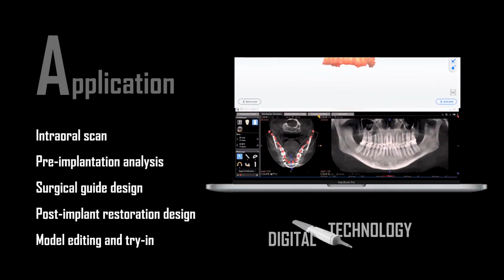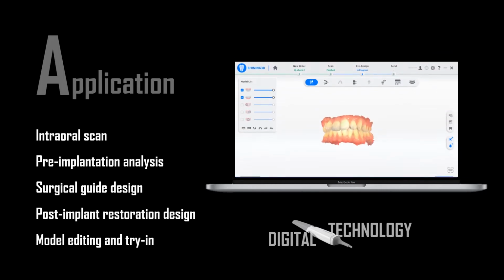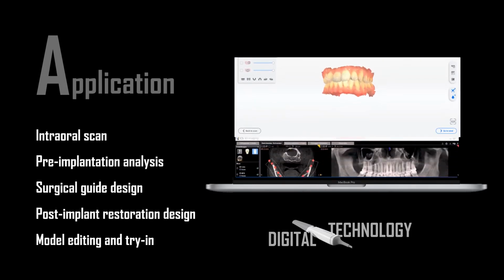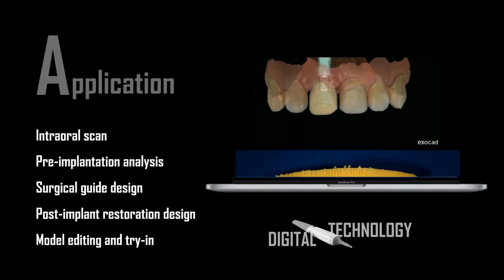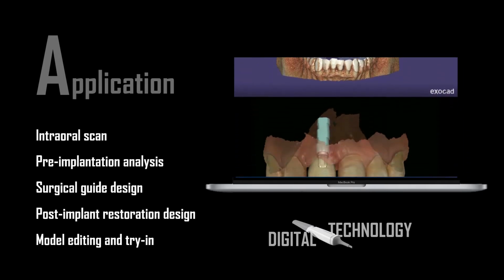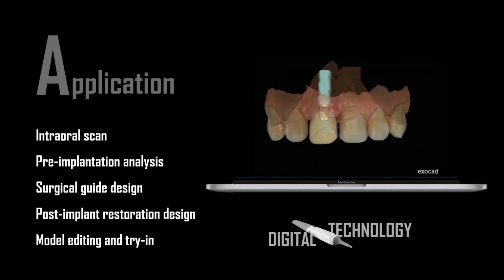We all know that it is a general tendency for the dental diagnostic and treatment industry to move from the traditional era to the digital and modern one. Digital technology enables pre-implantation image analysis, virtual implant planning, guidance plate design and manufacture, implant aesthetic design and model editing to be widely used in diagnostic and clinical treatment, making it possible to achieve high precision, long-term stability, and foster real aesthetic implant restorations of anterior teeth.